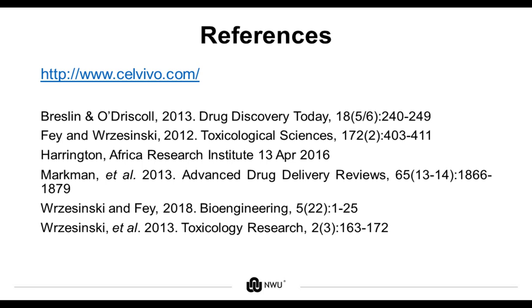It looks like we have another 2-part question here. Do you consider using serum in this model? And which serum do you consider in the media? Yes, we use FBS in our media, and it's exactly the same percentage as what you would use in 2D. I don't want to say our brand name, but we use normal fetal bovine serum that is for cell work. It's sterile, filtered, gamma irradiated.